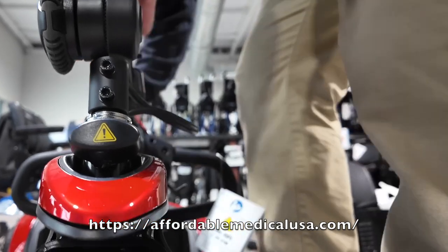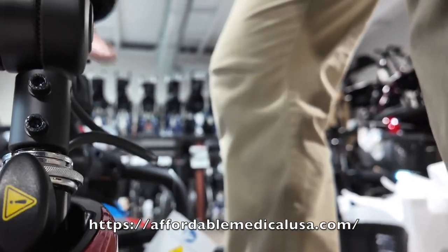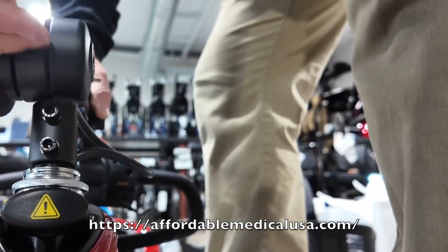When you go to lift this, if you don't have it activated, it will swing on you when you're trying to pick it up — it'll be all over the place. So you lock this and tighten it up so it doesn't move. You have to turn this in order to use it.